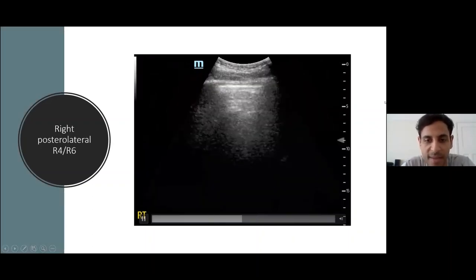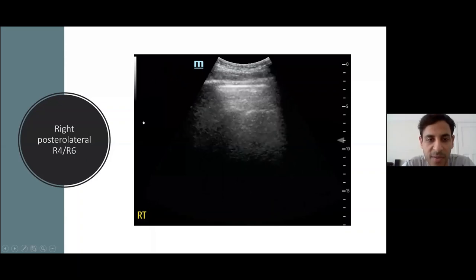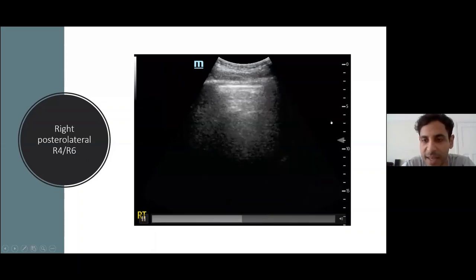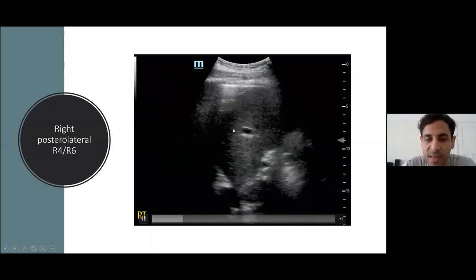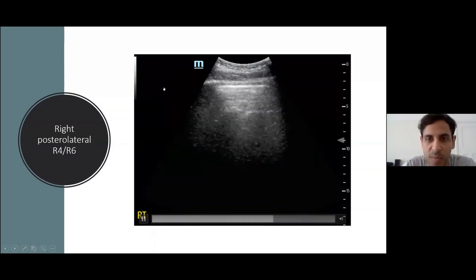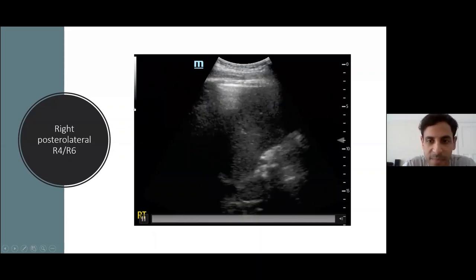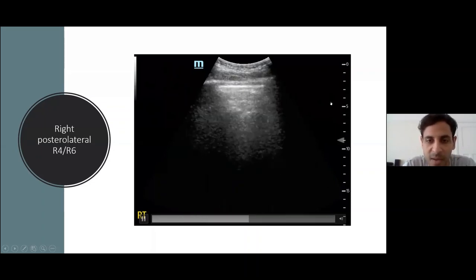On the right posterolateral aspect, the head is to the left and tail to the right. We see the liver, and as the patient takes a deep breath in, normal lung comes in — the lung curtain sign — because nicely aerated lung obstructs the view of the liver as it descends. Completely normal on the right side.